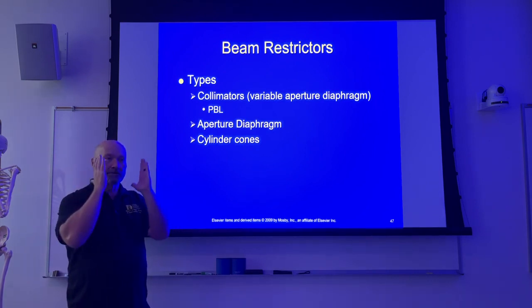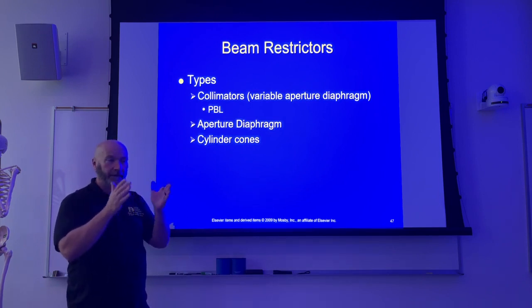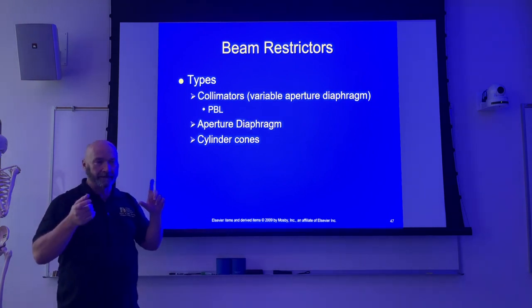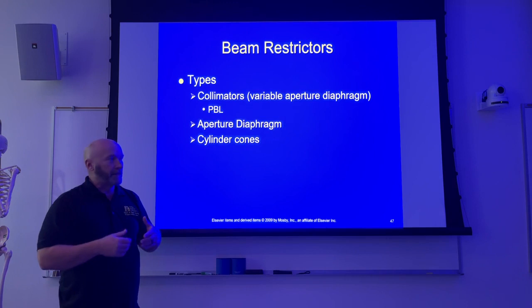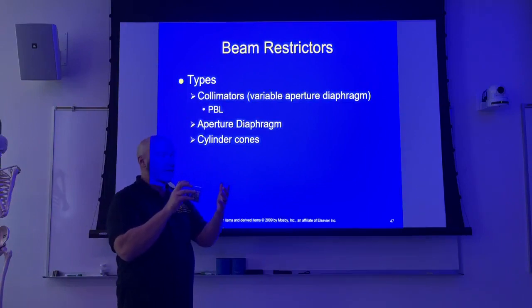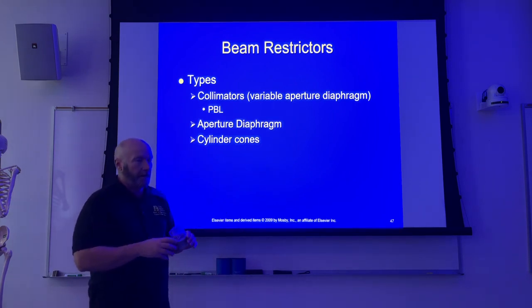And those rails should be parallel to each other and on two sides of the little plastic window that you can look up and you can see where the light and the collimators are. Lower set of shutters. And that tray will extend three-dimensionally this beam restrictor and put it as close to the patient's anatomy as you wanted it to go.